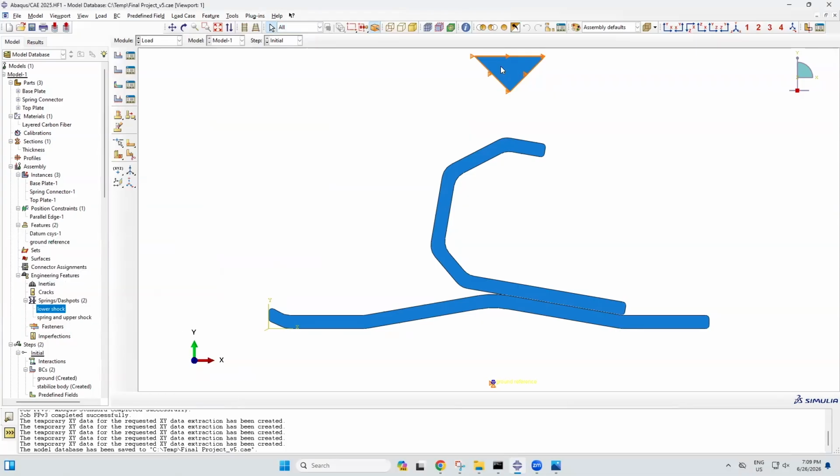Because I made the spring connector rigid, it does not matter where I applied the load on the spring connector because it is only allowed to move down. Thus, any weight or load applied will automatically force the overall part to move down.